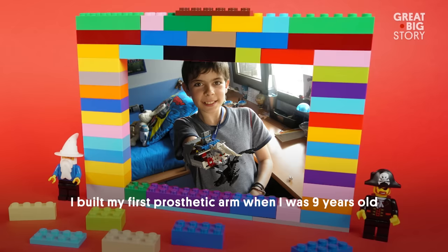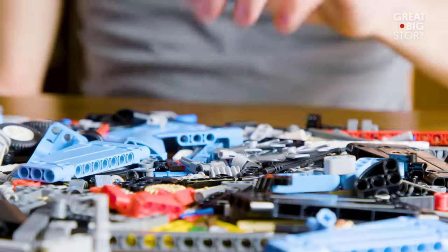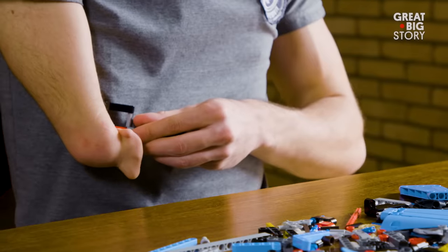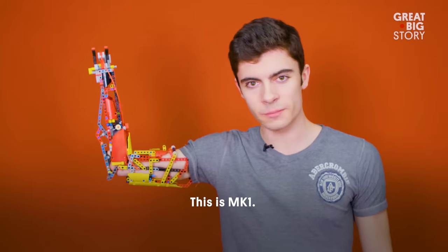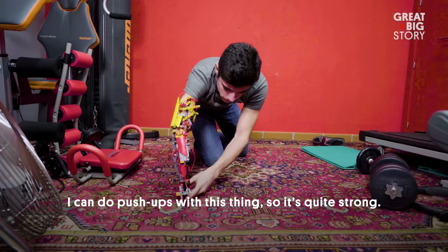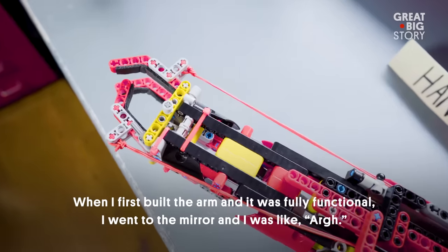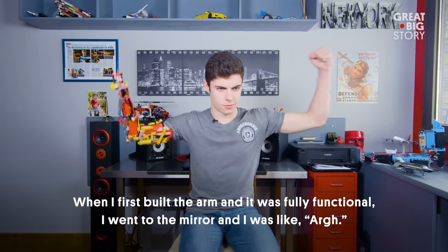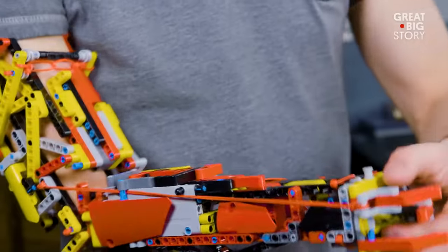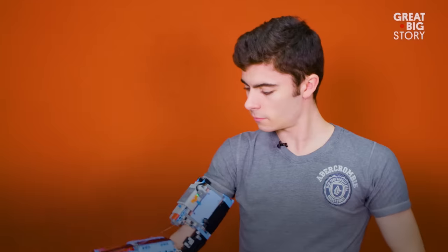I built my first prosthetic arm when I was nine years old and I built it around my hand. It started as a boat shape, but unfortunately the Lego bricks weren't strong enough. It wasn't for another nine years till he would try again. This is MK1 — this is Lego Technic, the sophisticated part of Lego. I can do push-ups with this thing, so it's quite strong. When I first built the arm and it was fully functional, I went to the mirror and was like, oh, oh, oh. That model, the MK1, only took five days to build.